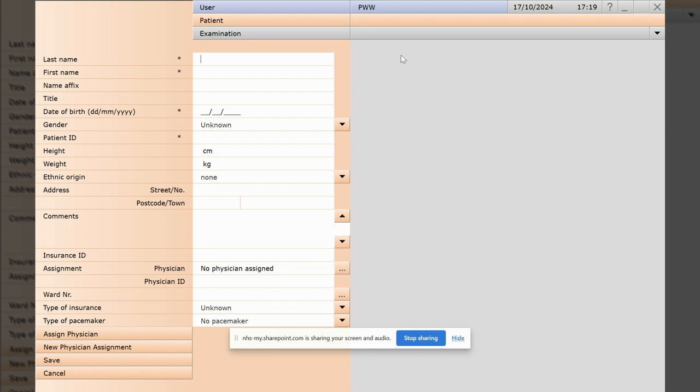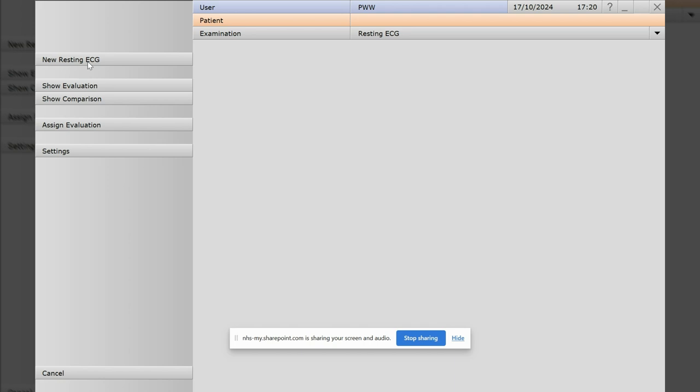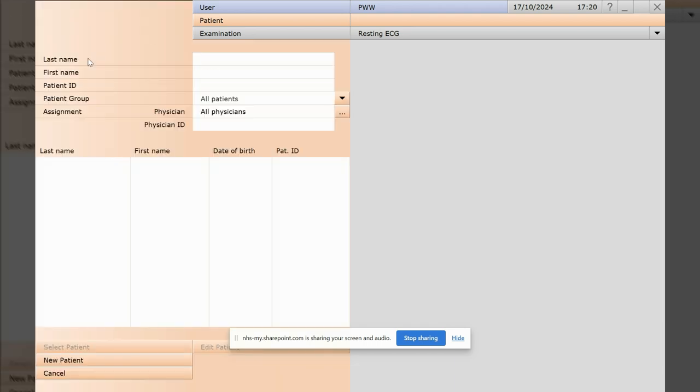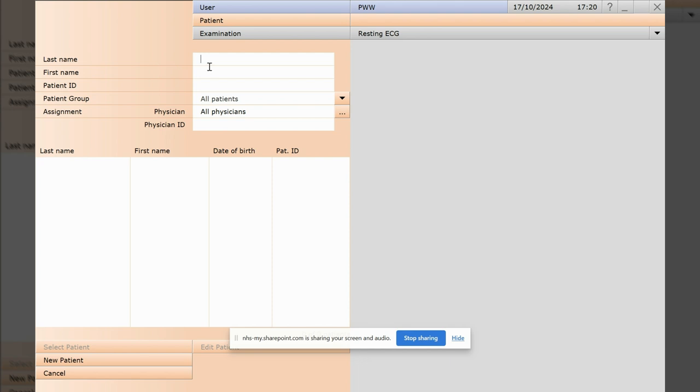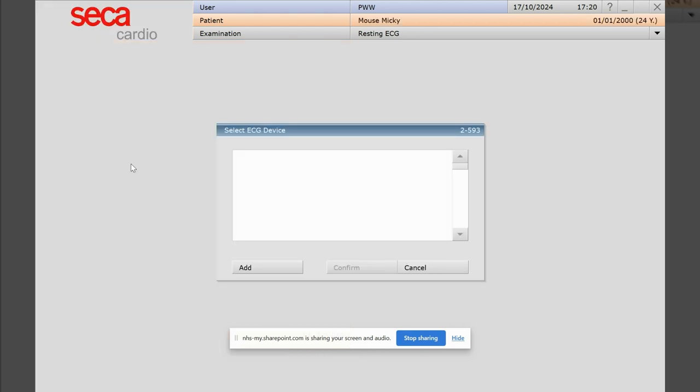So now we can go back up to the grey bar and click on examination. It's a resting ECG that we want to do, so top left resting ECG, new resting ECG. And then patient name, we'll just type in Mouse, we'll get the patient we just entered. Double click on that and add.